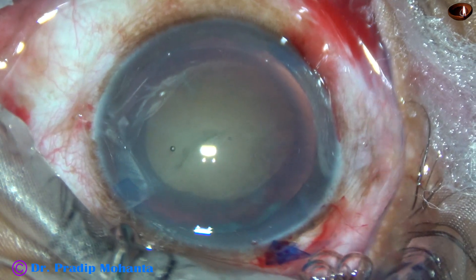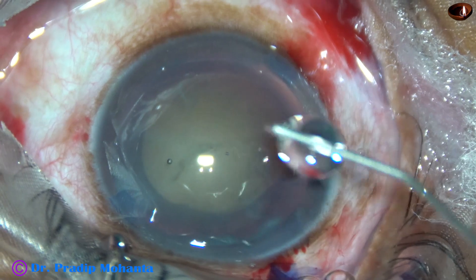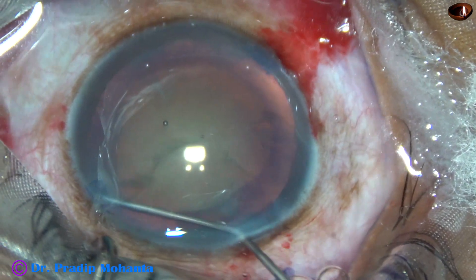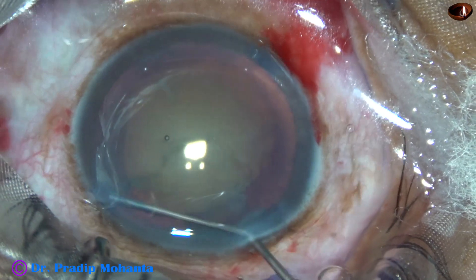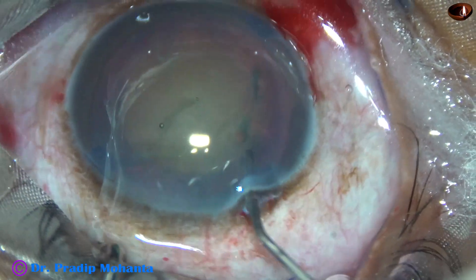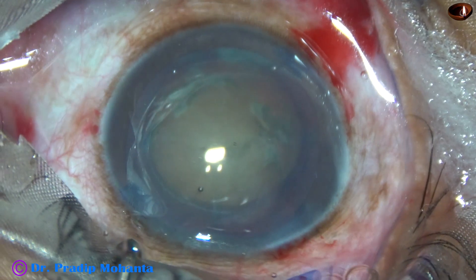Now hydrodissection. BSS and a 27-gauge cannula is used. The fluid wave is detected just underneath the anterior capsular rim. The nucleus is mobilized and the nucleus is rotated.